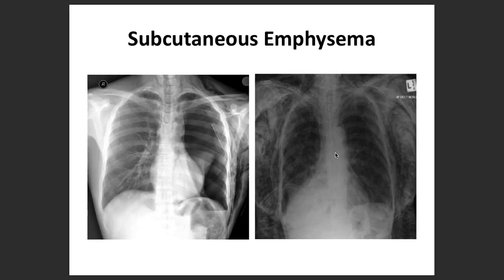So, for example, there is a pneumothorax, the patient is gasping in front of you, and you are not able to identify that. It's not good. So that is why I try to give you a little bit of an overview of everything.